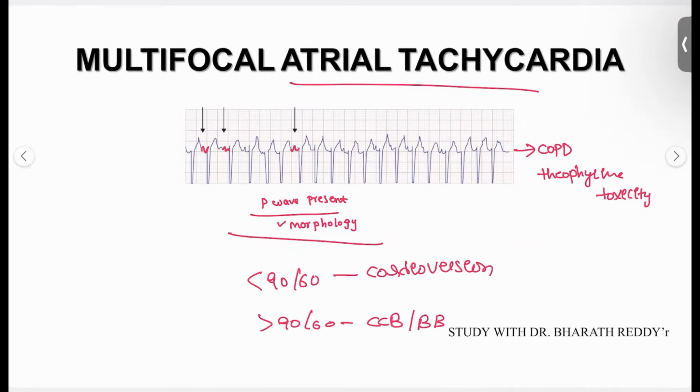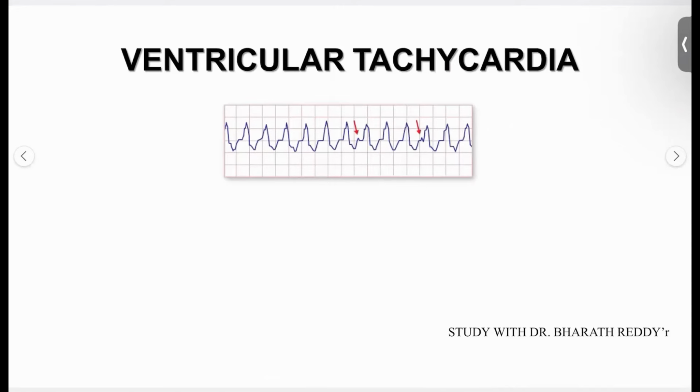All right. Next, moving on to ventricular tachycardia. There is a monomorphic one and a polymorphic one. What is ventricular tachycardia, guys? In the entire tracing here you can see the wide QRS complex, wider than 120 milliseconds. You cannot identify where the P waves are and where the QRS complex is. So the morphology of the entire tracing is changed. This is how patients present with ventricular tachycardia.